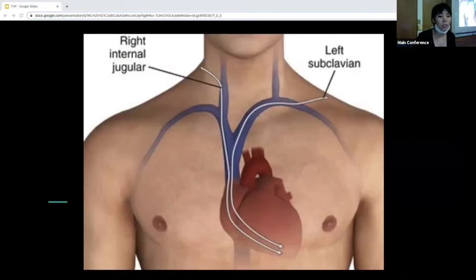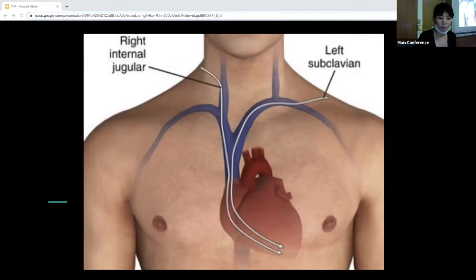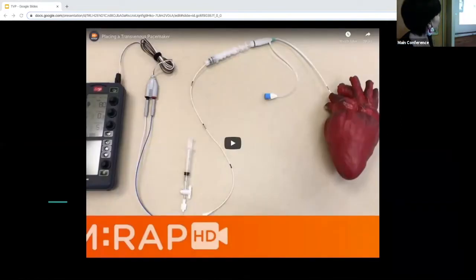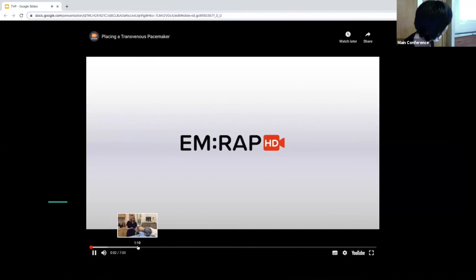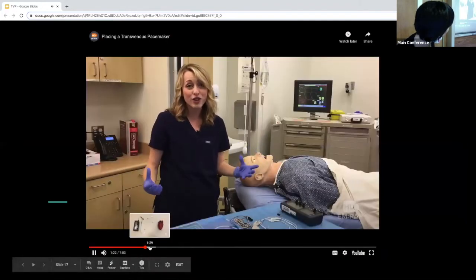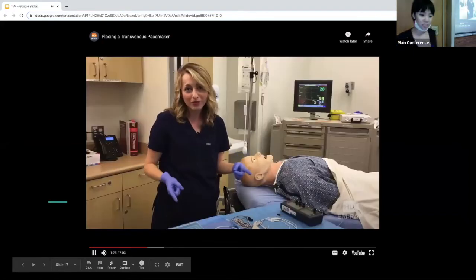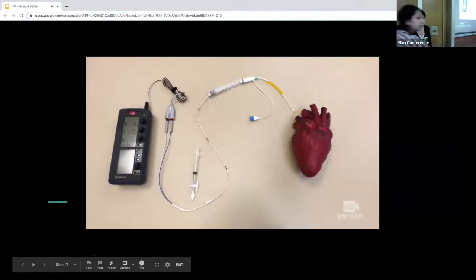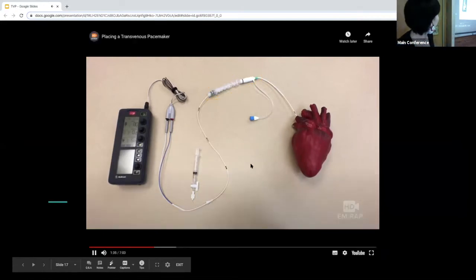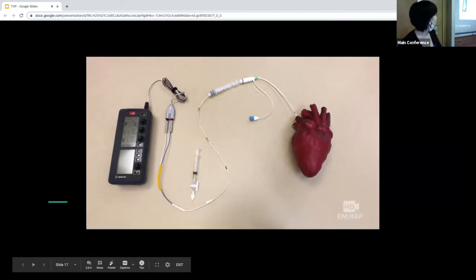In terms of anatomy, you're going to try to do right IJ placement because you want to keep the left subclavian as a permanent pacemaker site. Here's a video on the procedure itself — a quick overview showing that the pacing wire comes in via the SVC through the right IJ, into the right ventricle. There's a sterile sleeve over the pacing wire. This syringe inflates and deflates the balloon, and through adapter pins it plugs into the connecting cable, which goes into the pacing generator.